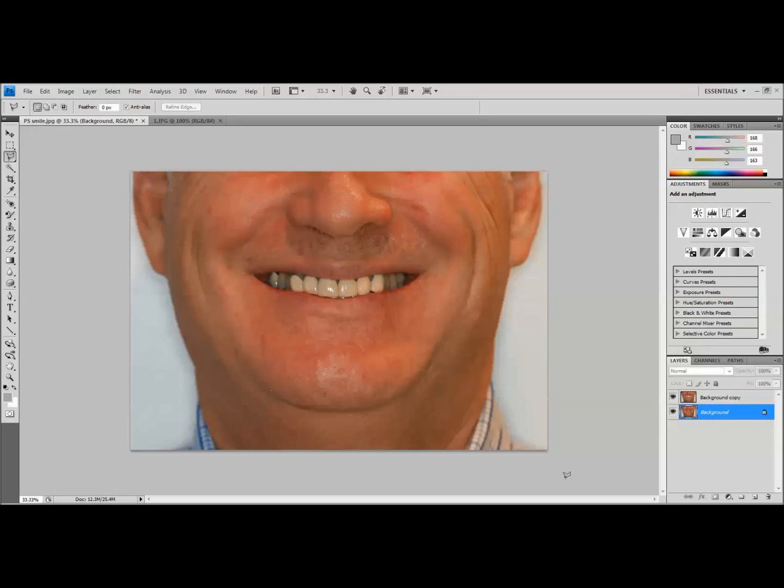This is Dr. Corey Glenn and I'm going to demonstrate another technique that I use with Photoshop. This one applies more to when you're trying to do a larger simulation where you want to maybe do a full mouth rehabilitation or give the person a really big picture view of what you could accomplish if you treated a lot of teeth.